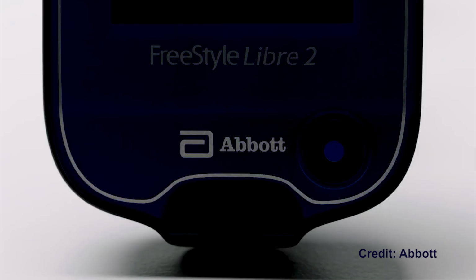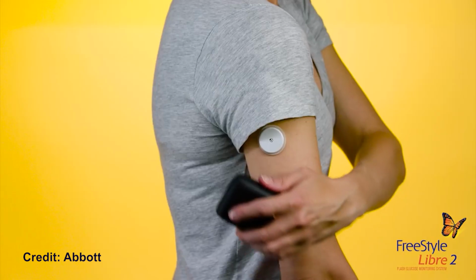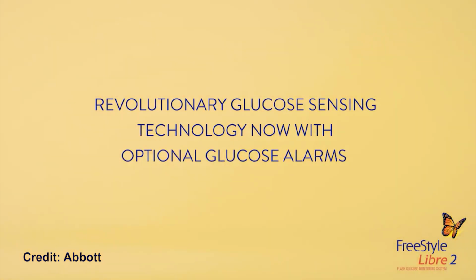I have made a dedicated, full in-depth review video about FreeStyle Libre 2. You can check it up here to find all the information that you need to know about how this product works. The system will alert you when you are low or high by providing you with a low or high alarm, but it will not tell you exactly the glucose value. You need to scan the sensor with the reader or the app. Checking glucose also requires scanning. If you want to find out all the details about FreeStyle Libre 2, you can check my dedicated video about it up here or in the video description.